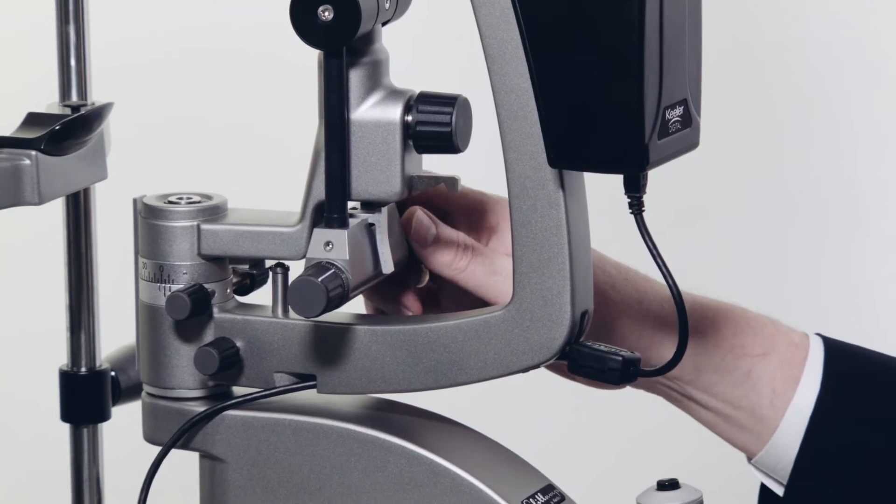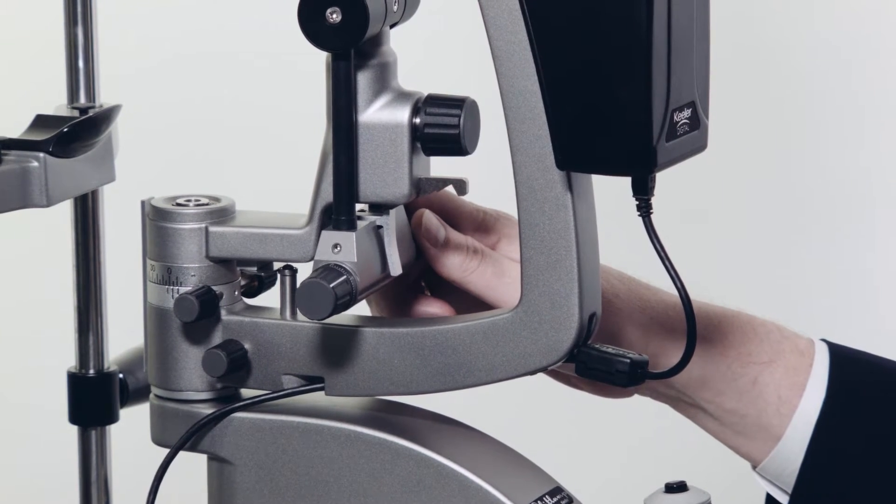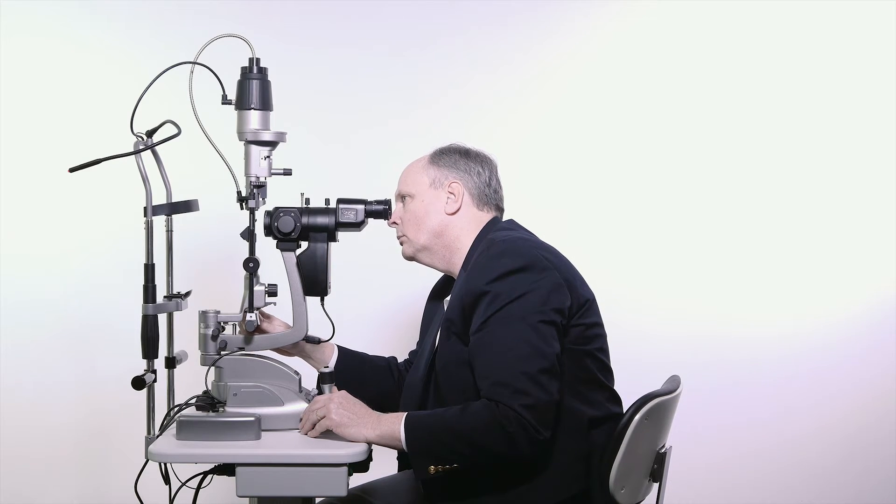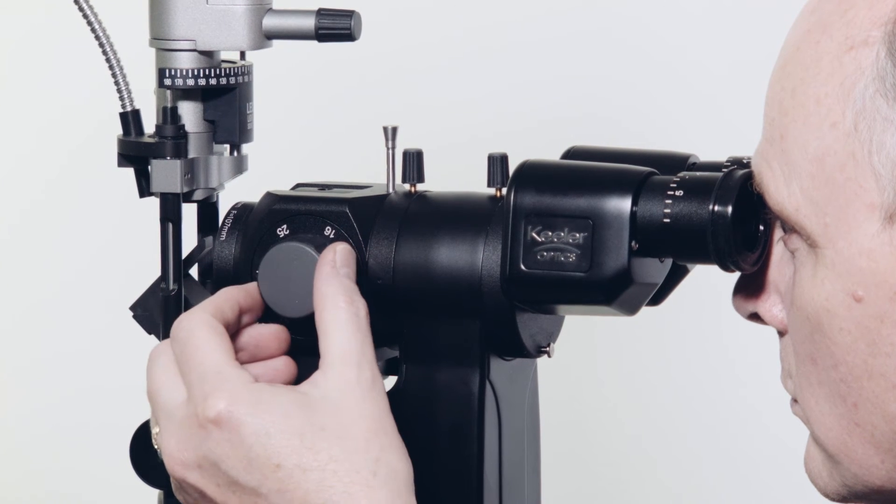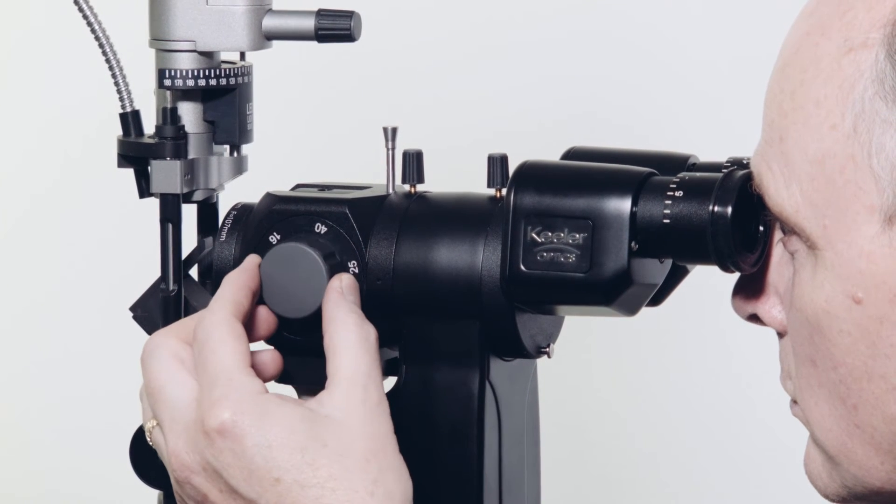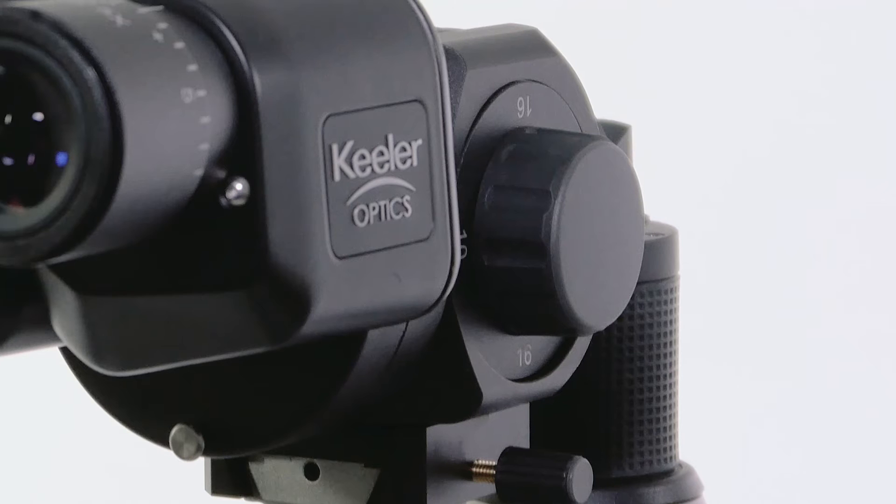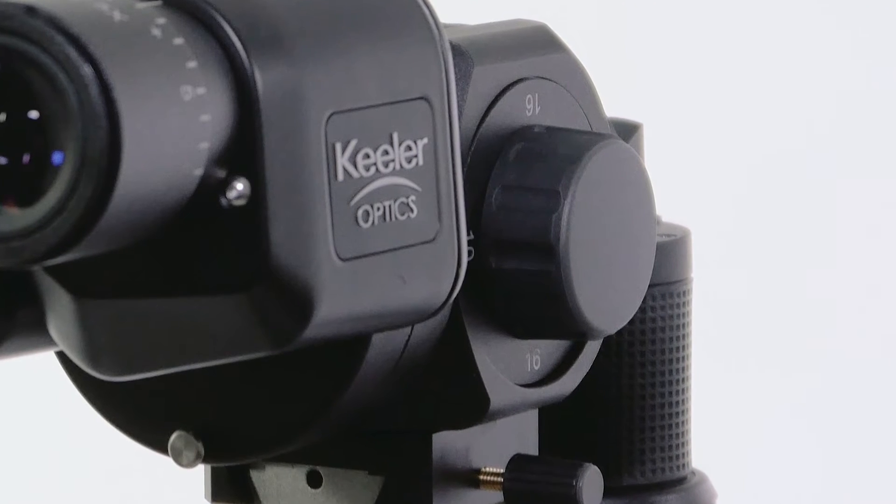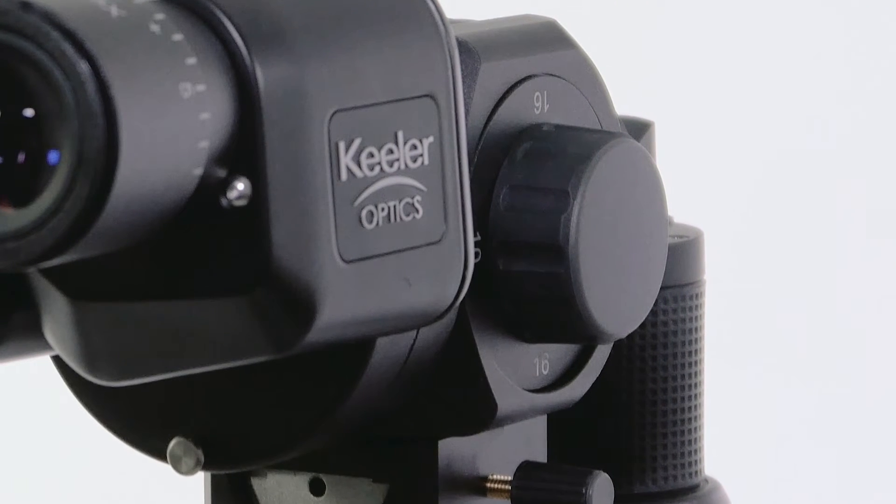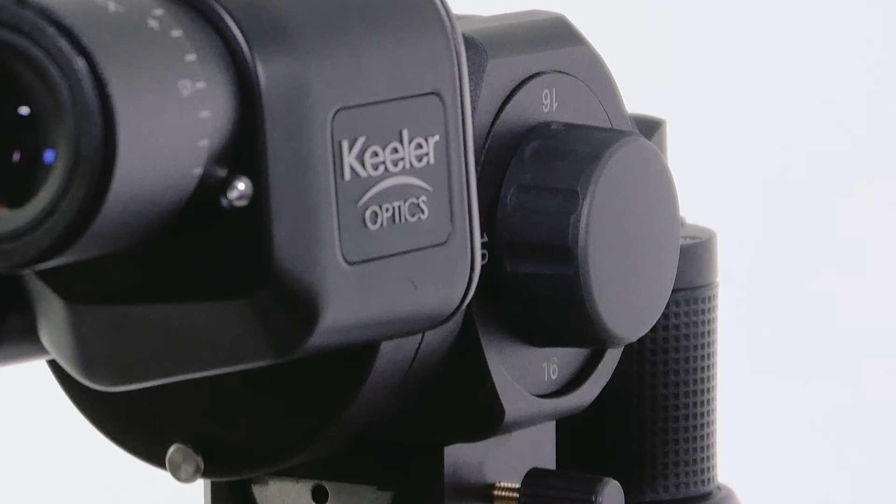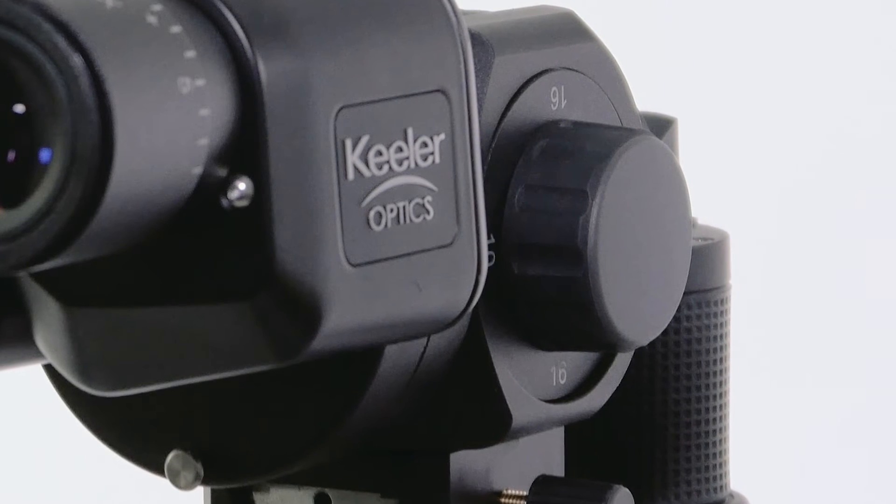Adjust the slit width using this adjuster. Slit width ranges from 1 to 12mm. Magnification is adjusted using the 3 or 5 step drum here. Magnification ranges from 6 times to 40 times on the 5 step drum and 10 times to 25 times on the 3 step drum.